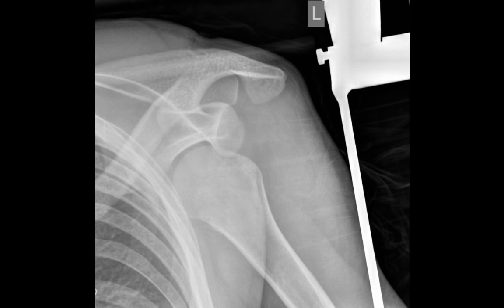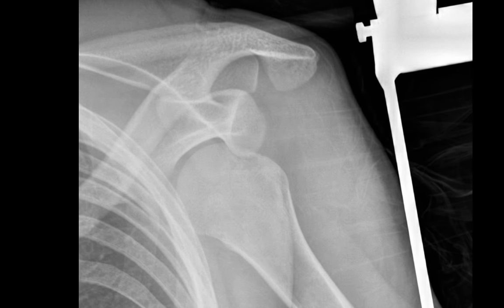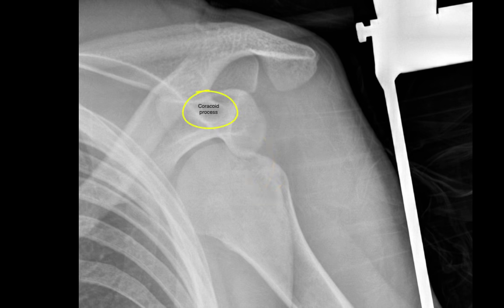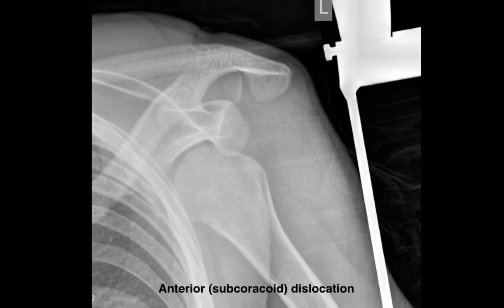As we look at a few examples, feel free to pause the video to take a closer look and come up with your own answer. So what's abnormal about this shoulder joint? Hopefully you can see that the humeral head is outside of the glenoid fossa. It's below the coracoid process, so we know it's an anterior — in this case, a subcoracoid dislocation.